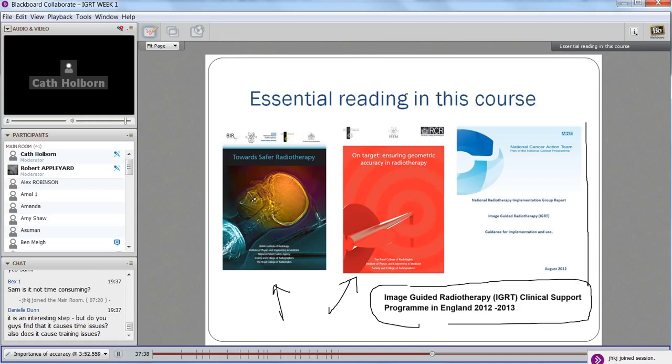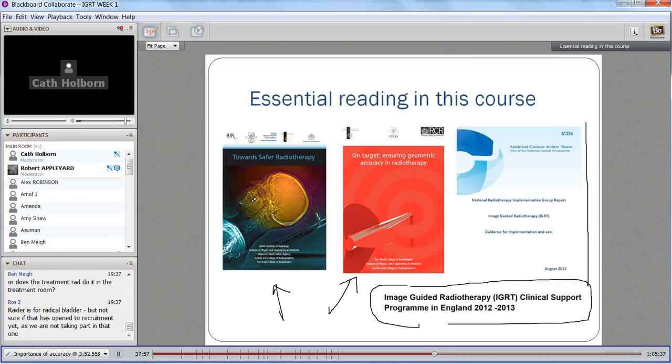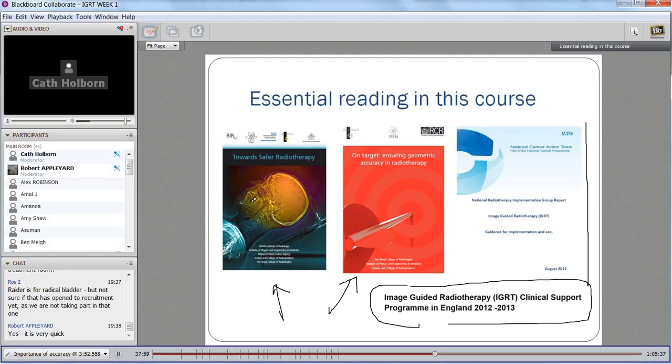And obviously, if a patient had a really empty bladder and they needed a full bladder, the radiographers could ask them to go and have a bit more water to try and fill their bladder up further. And they would have done all that before they've even had to take a cone beam CT scan. So it's a way of getting a rough idea of how well the bladder volume relates to when it was originally planned, without actually giving a cone beam CT dose.